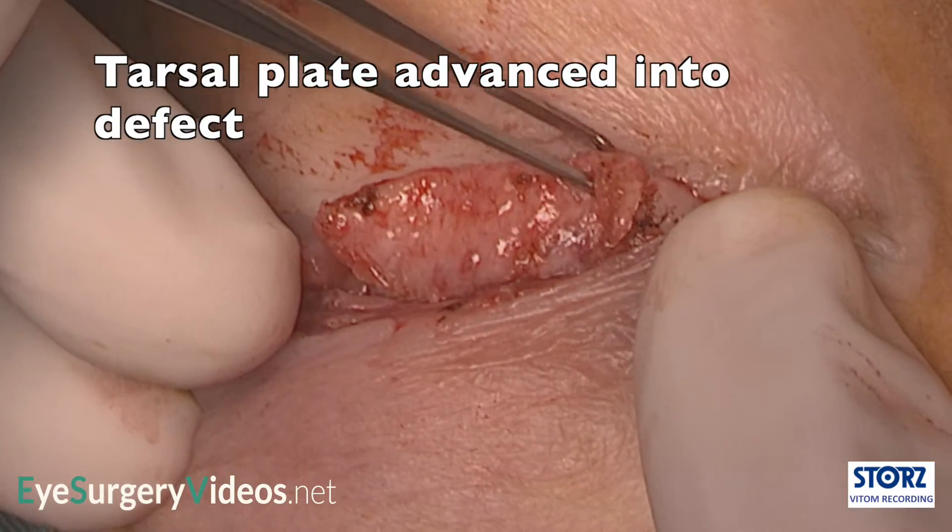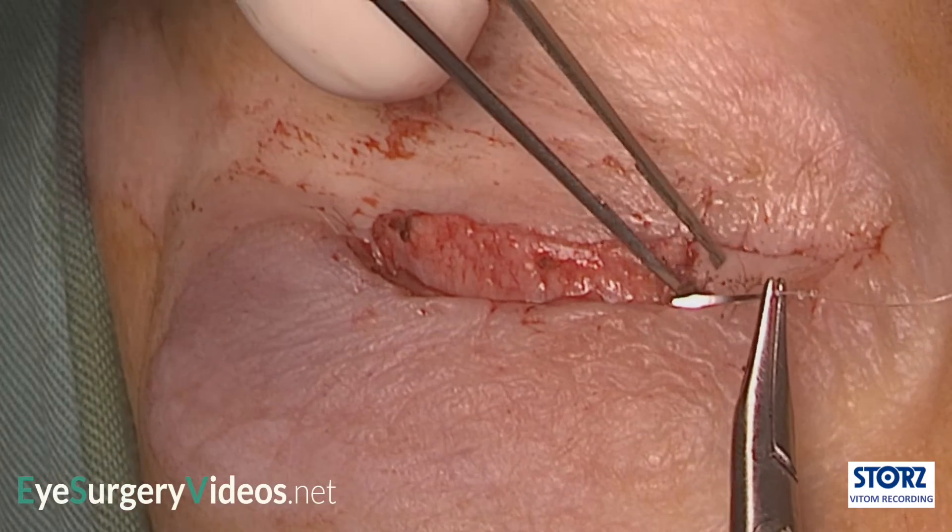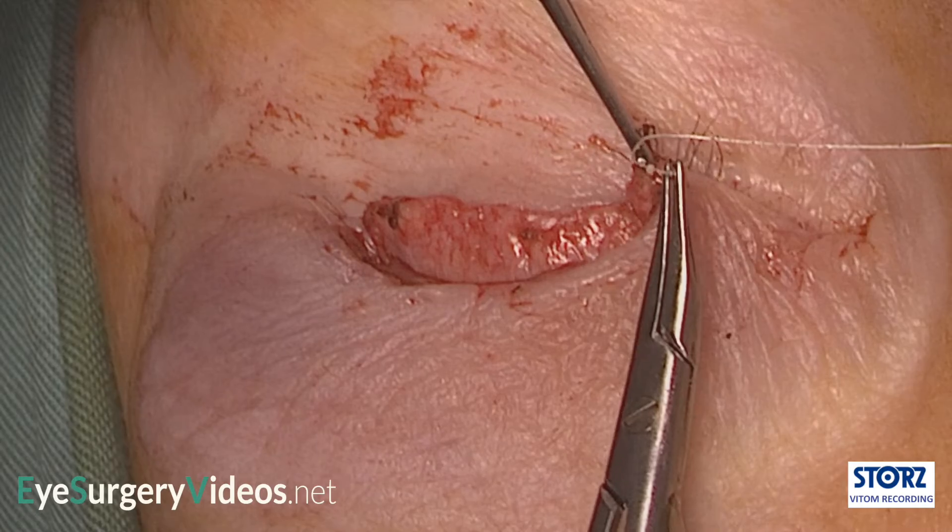The flap is sutured in situ. It is sutured a couple of millimetres advanced of the neighbouring host tarsus, as it does tend to retract a little over time.